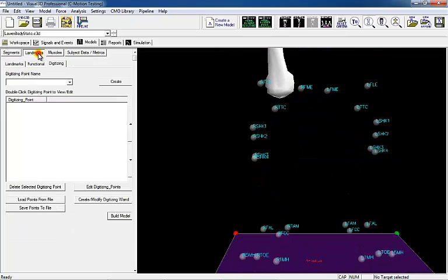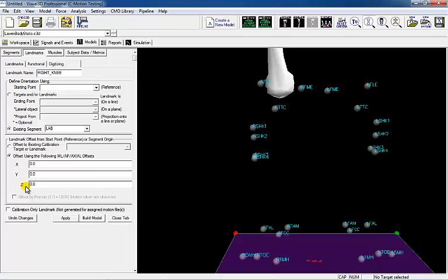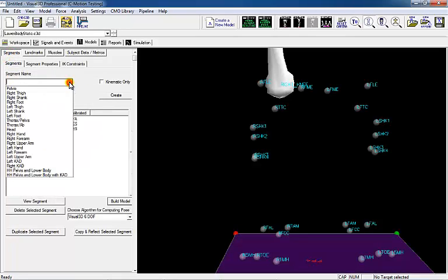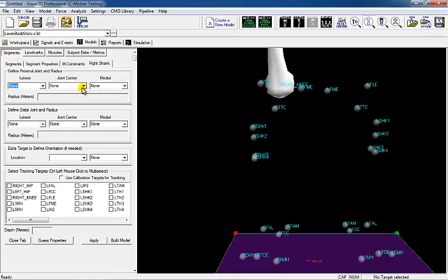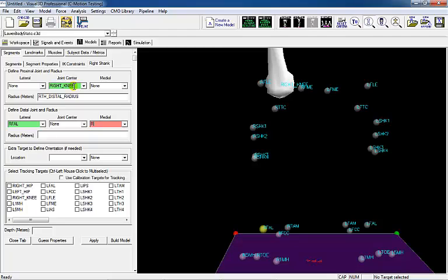Before creating the shank segment, create a landmark to represent the knee joint center. The knee joint center should be along the line of the medial lateral knee target, placed halfway between the two targets, and the target will only be needed for the calibration trial. Landmarks will appear as purple targets in the 3D viewer. There are numerous ways to define the shank. For this example, use the virtual knee joint center to identify the proximal end of the shank. Multiple equations can be used to define the proximal end radius, such as half the distance between the medial lateral knee targets or the distal radius of the thigh. Select the medial lateral ankle targets as the distal end of the segment and select the four targets on the thigh cluster as the tracking targets.